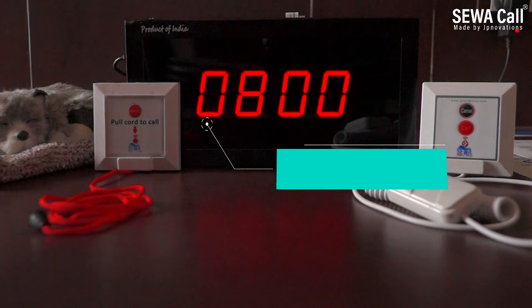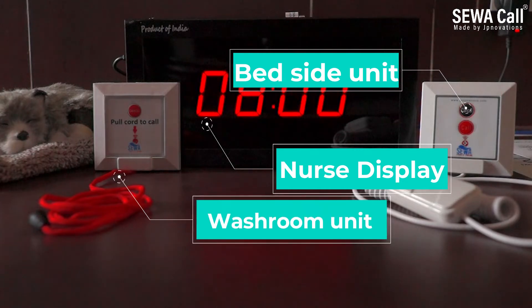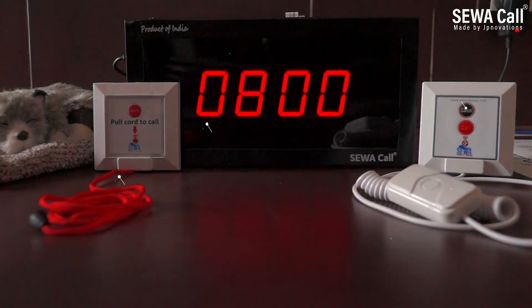This system comprises of a nurse panel, bed units, and washroom units. The nurse panel works with a power adapter, and the bed and washroom units work on batteries, which last for around 9 to 12 months.